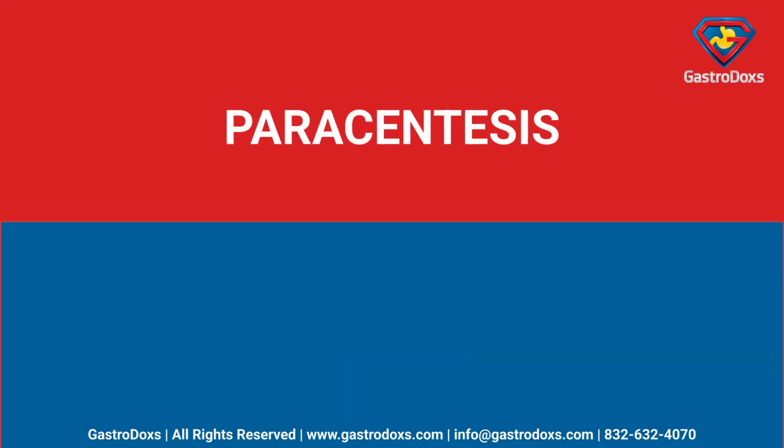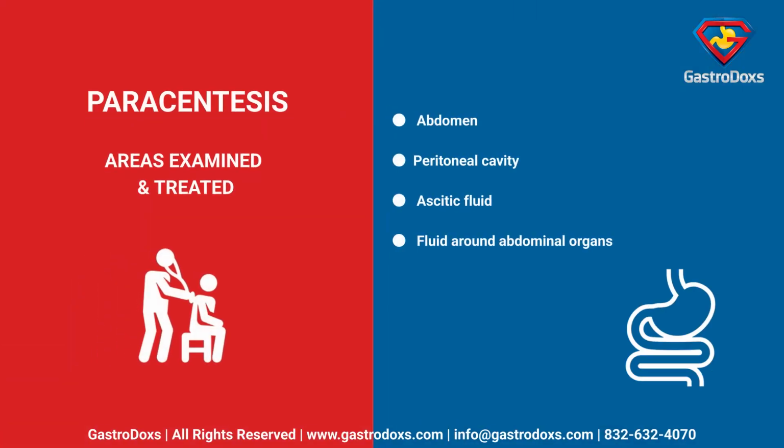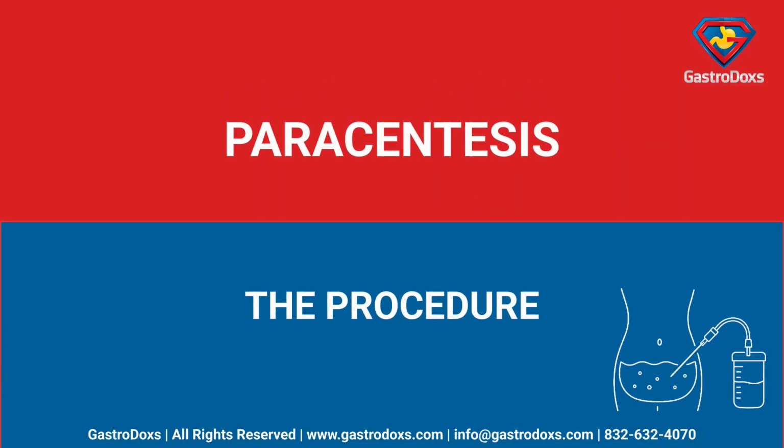Paracentesis. Areas examined and treated. Abdomen. Peritoneal cavity. Ascitic fluid. Fluid around abdominal organs. The procedure.